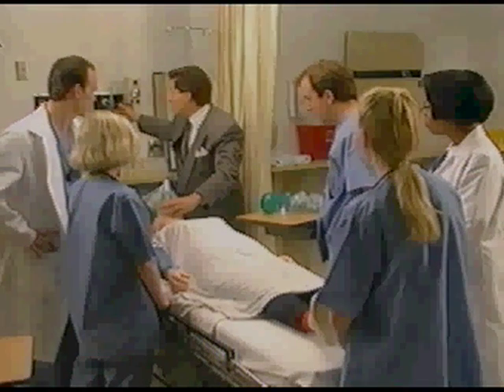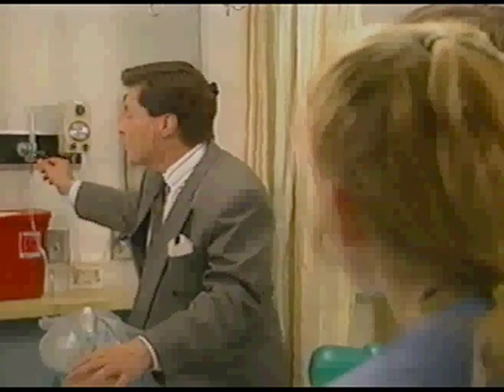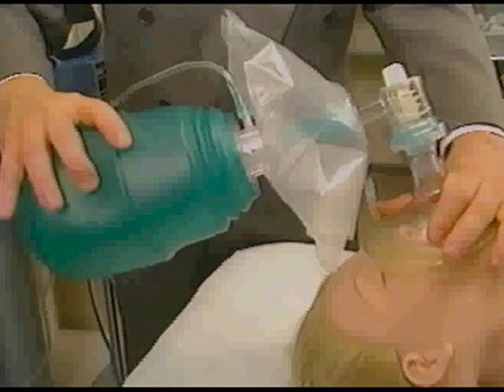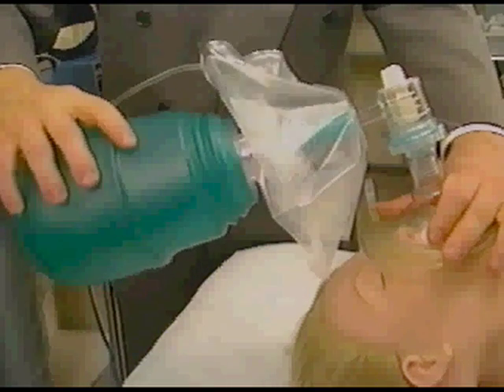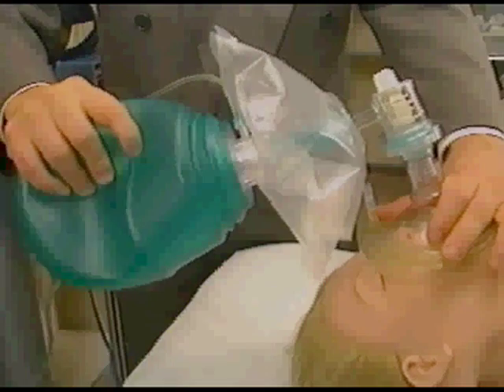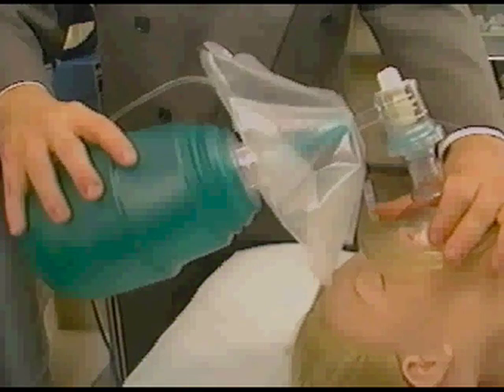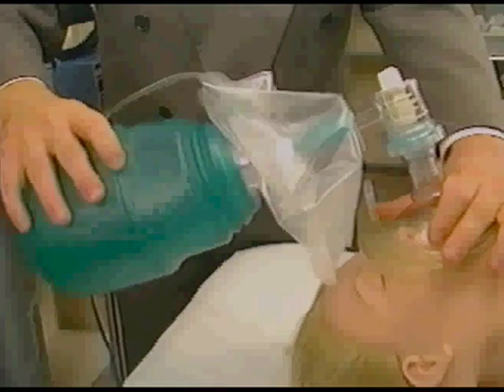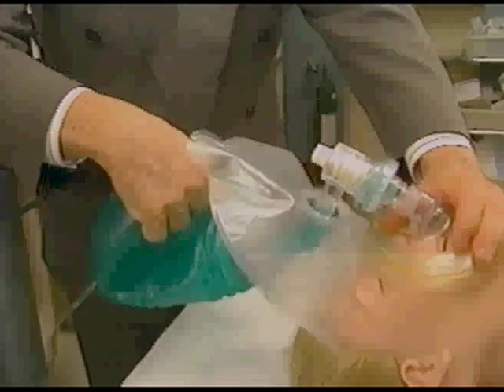Once you've hooked up the tubing, start the oxygen. We recommend 12 to 15 liters per minute to start with, or you can set the flow meter to flush. When a patient isn't breathing, you set it at a rate appropriate for his or her condition. If a patient is breathing, follow his or her ventilatory pattern and avoid excessive pressure. Notice that while I'm bagging, I'm able to watch the oxygen reservoir breath by breath without looking away. You can also roll the bag instead of squeezing it — rolling the bag at intervals helps prevent fatigue.